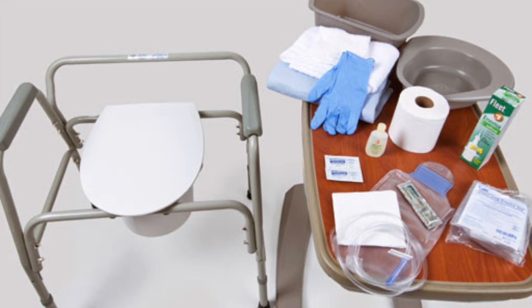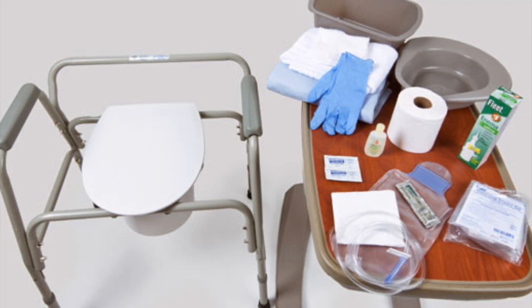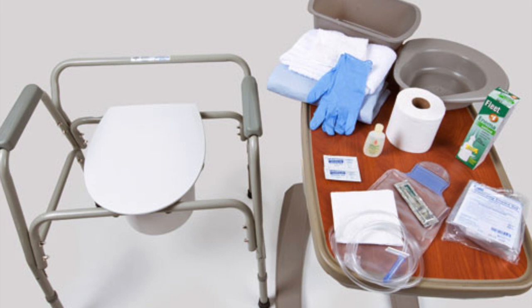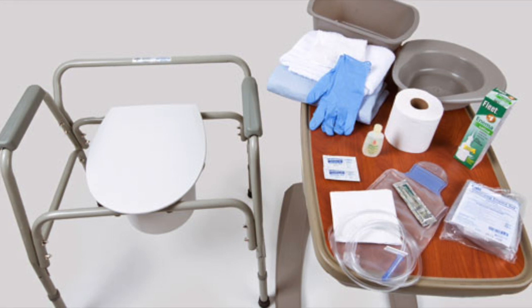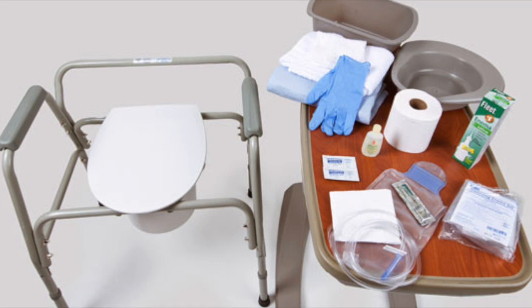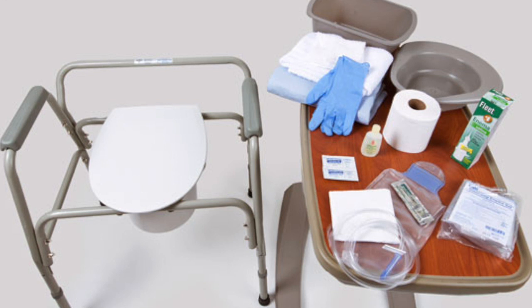Next, roll the plastic bottle from bottom to tip until all of the solution has entered the rectum and colon. Instruct the patient to retain the solution until the urge to defecate occurs. This usually occurs within 2 to 5 minutes. Next, place layers of toilet tissue around the tube at the anus and gently withdraw the rectal tube and tip. Explain to the patient that abdominal cramping is normal and ask the patient to retain the fluid as long as possible until the urge to defecate occurs. Like I said before, it's usually 2 to 5 minutes.